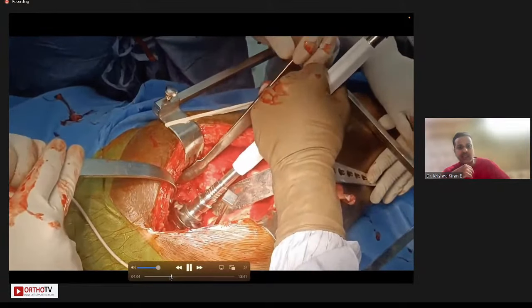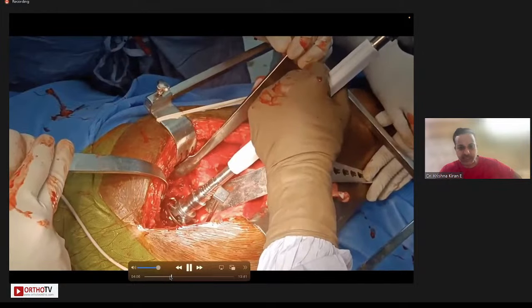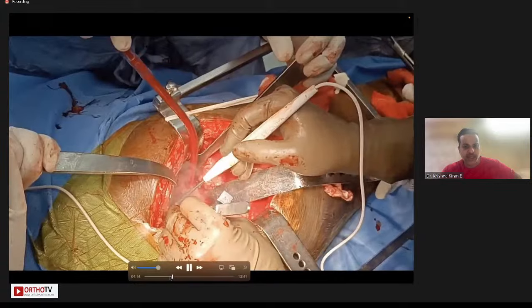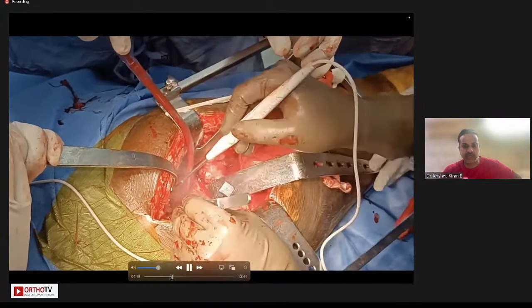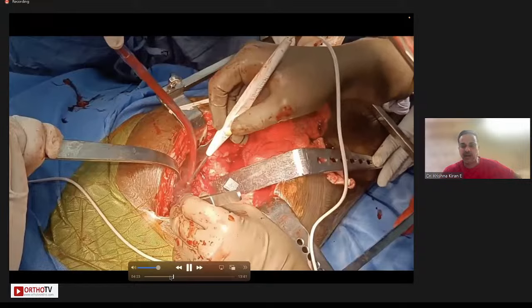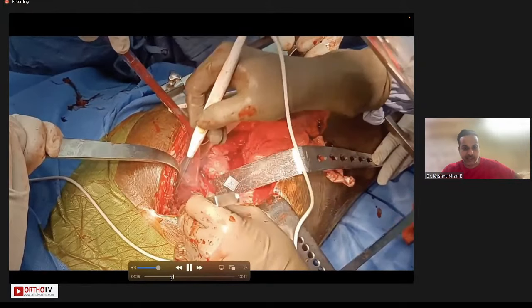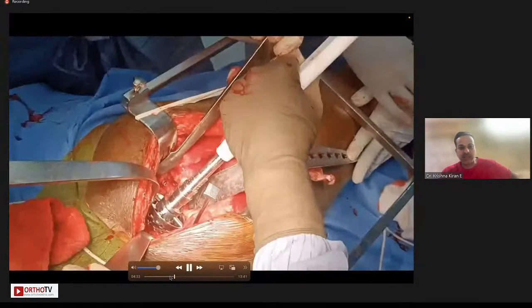And we have described this technique as a video technique in one of the American Academy journals. And now you can see that I am just using the reamer to size the acetabulum in the anteroposterior direction. We all know that there is no superior acetabulum, but we still need to get what is called the AP capture position for that particular patient. So if there is 40% host bone, I'm trying to engage the available anterosuperior and posteroinferior, or a posterosuperior to anteroinferior column, to get a two-point fixation. If you don't get this two-point fixation, then the socket will just fly out.